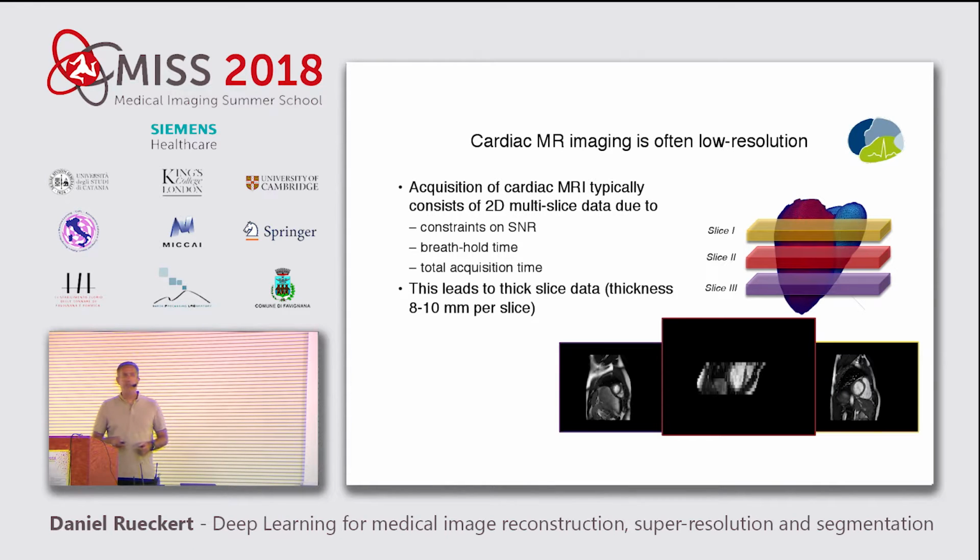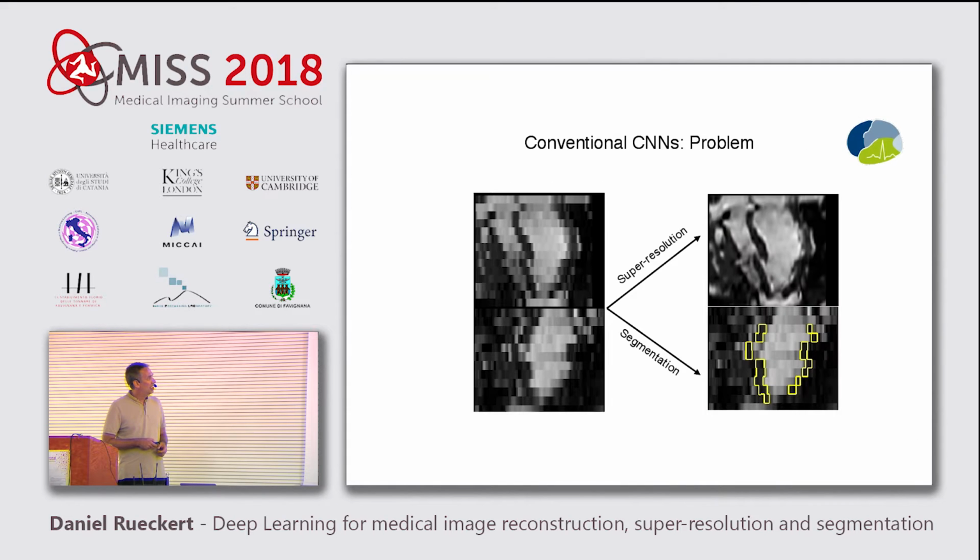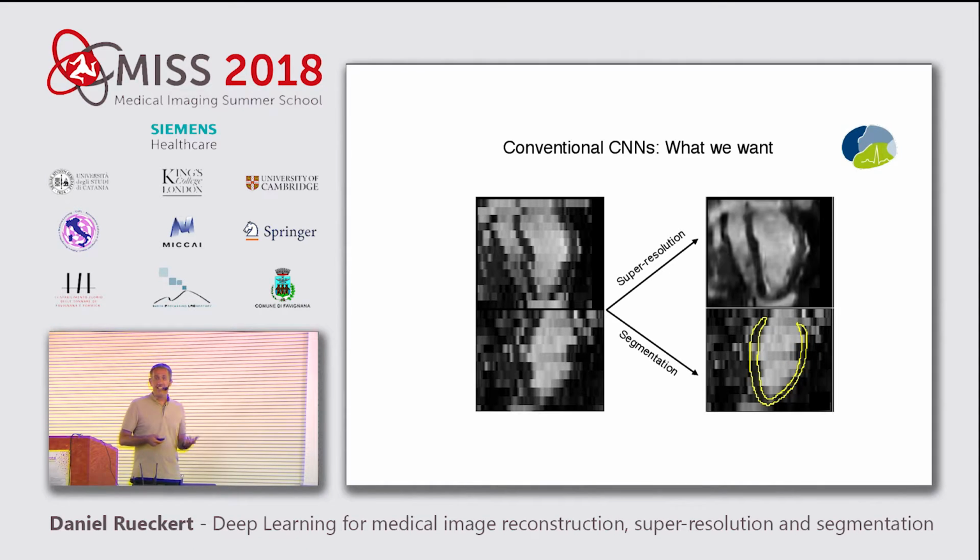Now, the great thing about deep learning is it solves every problem. It will also solve this problem, except if you apply super resolution to such data, you get an image like this. Now, if you show this to a cardiologist, they will wonder why you're still alive, because you have a number of holes here in your heart and your heart wall, and this heart can't really work based on what the machine learning has produced. And it's not really the fault of the machine learning, because you give it data which is inconsistent, correct?